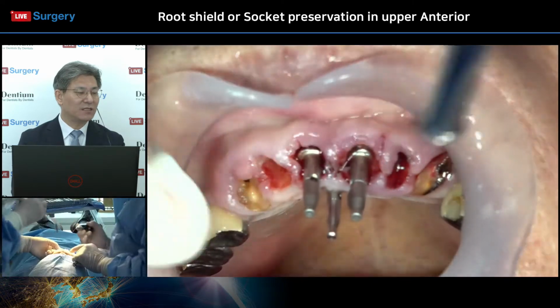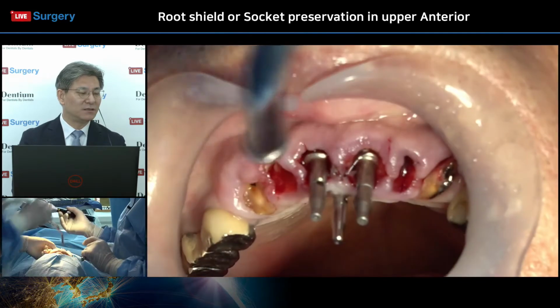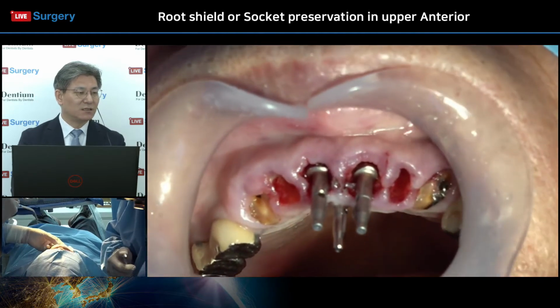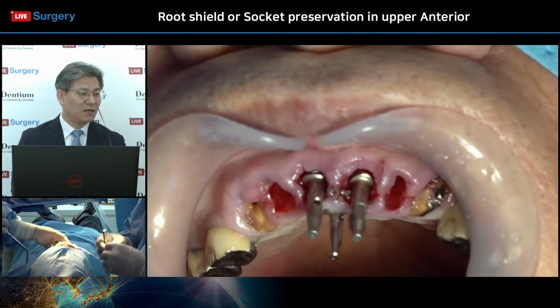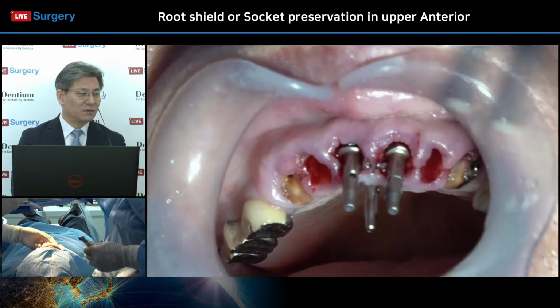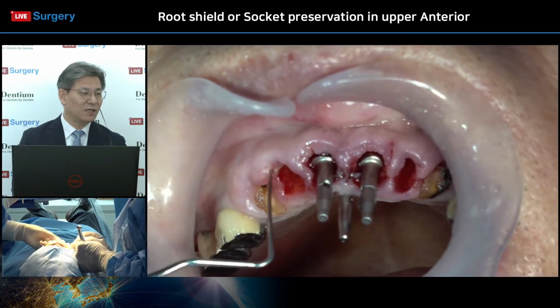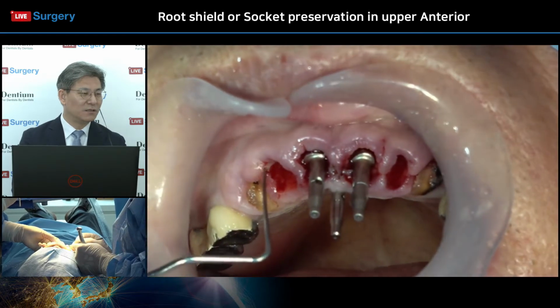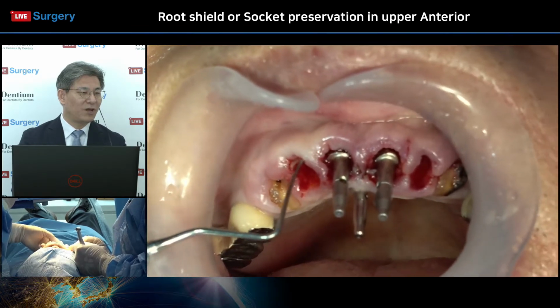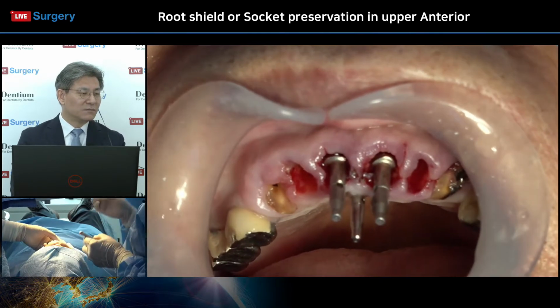This one is a K2 laser. After detoxification with the laser, and I think he is going to have, this one is thick. And try the bone sounding here. Around this, around 3 millimeters each side. On this side, 2 millimeters. 3 millimeters. So around 3 millimeters. So there is no way.